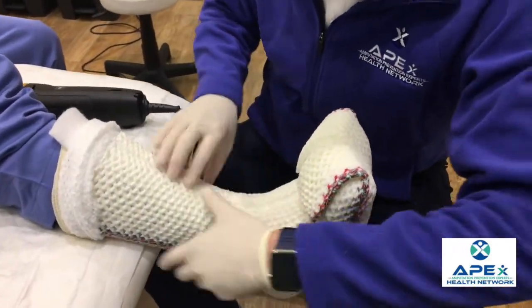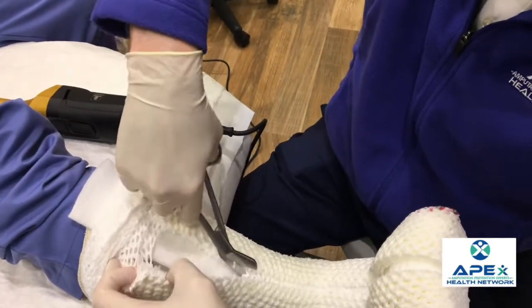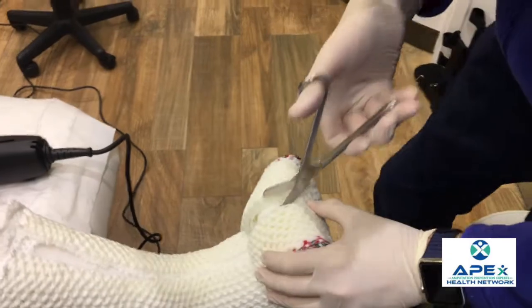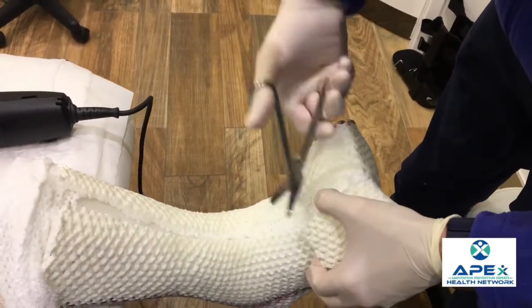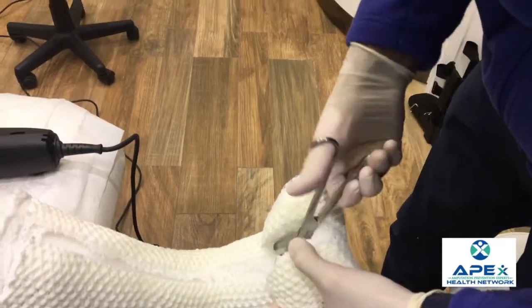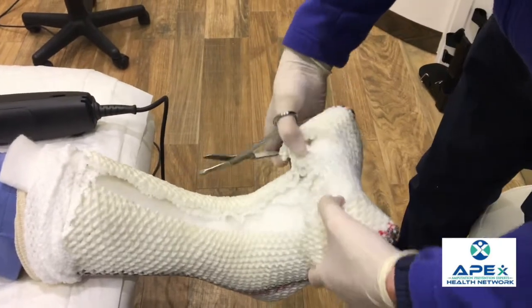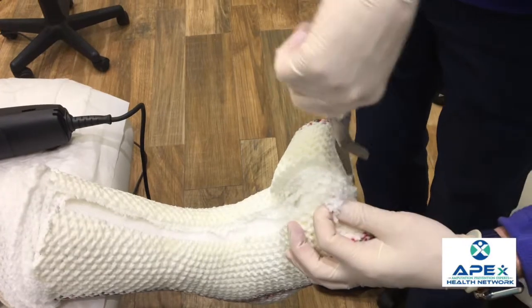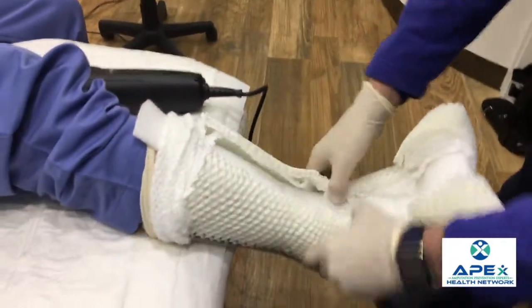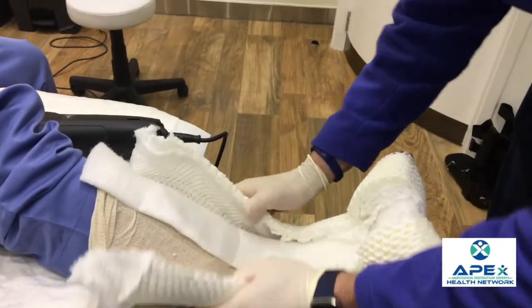Then you can just spread this apart and check to see that all the fiberglass has been cut. Once you ensure that, you still need the scissors because this cast is stuck to the underlying padding. Then you cut with the scissors through that underlying padding and the cotton. Now you can see underneath we have the felt pads that we used as a guide. This is pliable enough that we'll be able to get the patient's foot out without having to use a cast spreader.